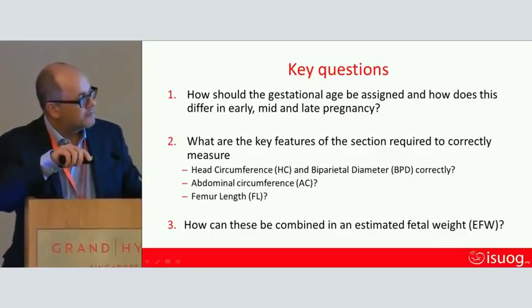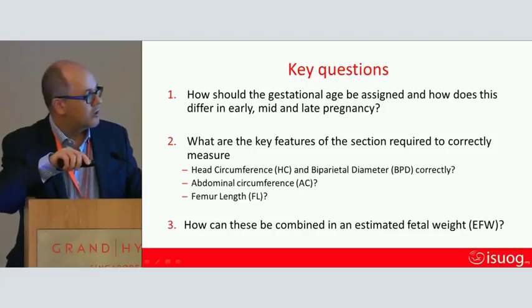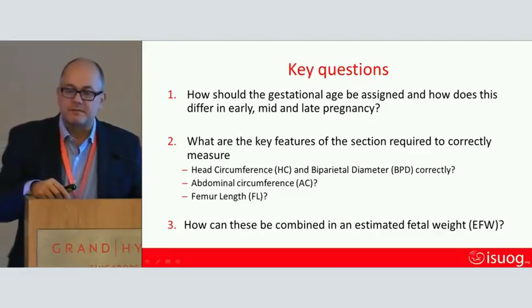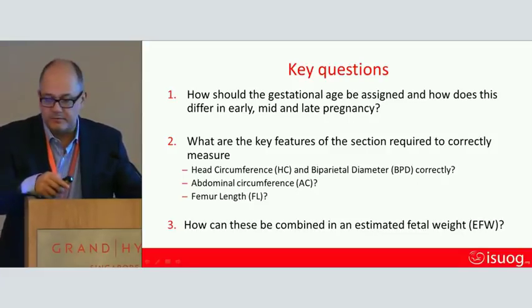And I'm going to use the abbreviations after this slide, okay? So I'm not going to use the whole word anymore. I will use HC, BPD, AC, and femur length, and how we can combine these measurements together in an estimated fetal weight, or EFW.